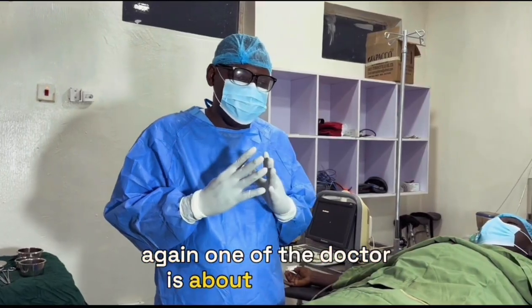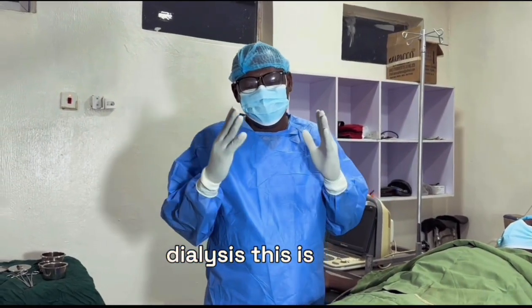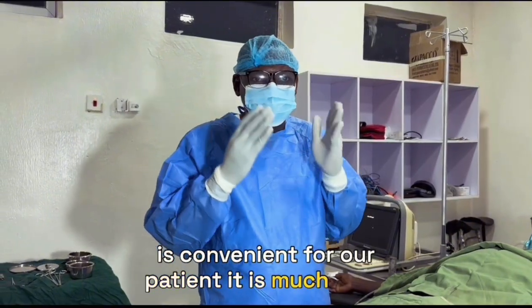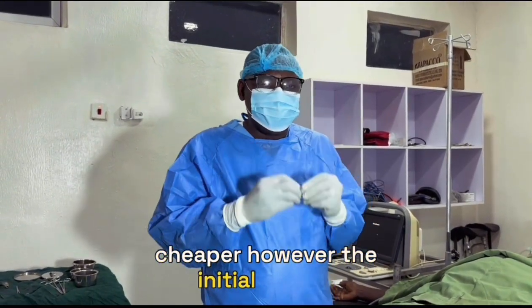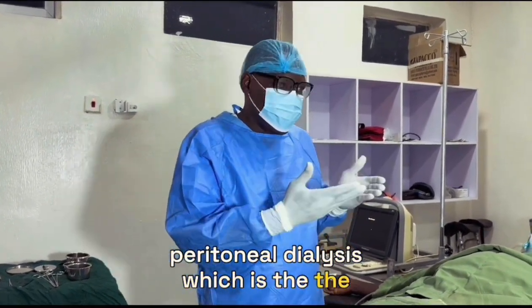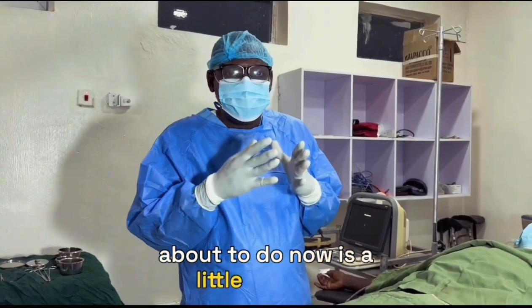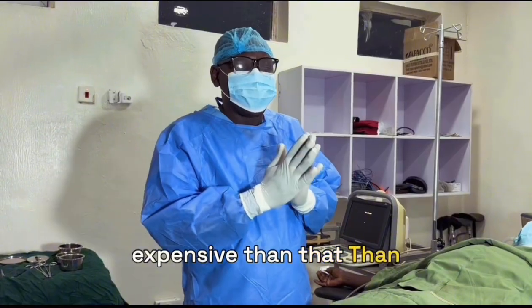Again, one of the other things about peritoneal dialysis, apart from the fact that it is convenient for our patient, is that it is much cheaper. However, the initial part of peritoneal dialysis, which is the peritoneal dialysis catheter insertion, which we're about to do now, is a little bit more expensive than hemodialysis.